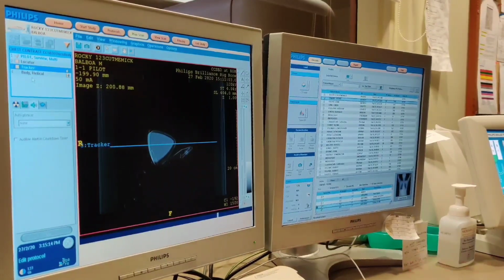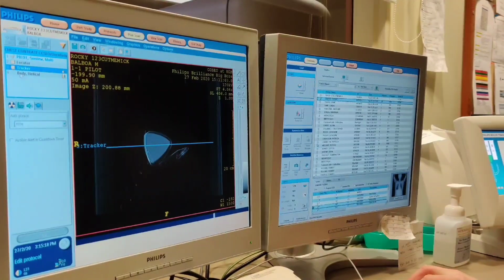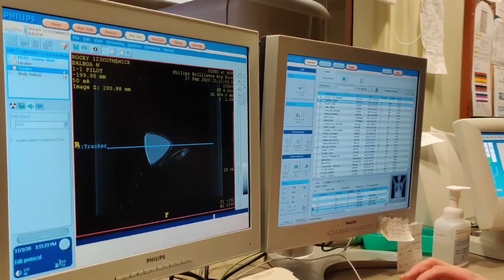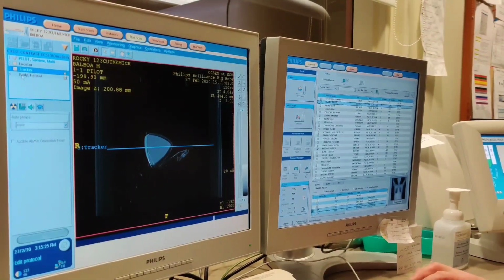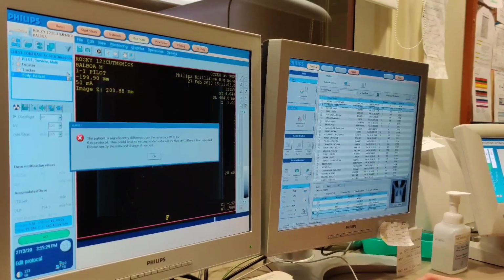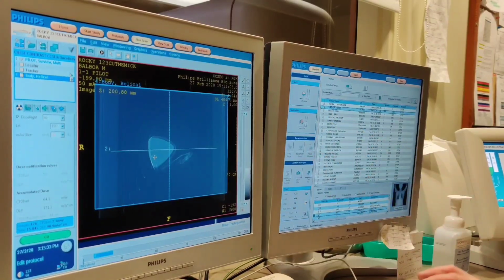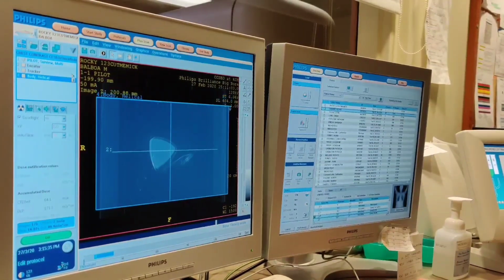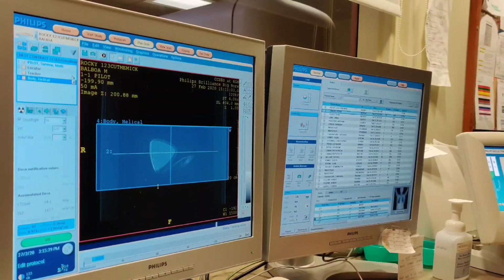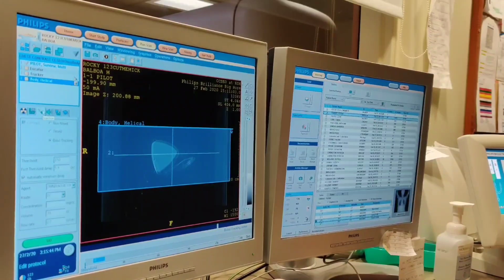And then last but not least, I need to map out the helical scan itself. So we've picked a level for our locator scan. We've selected all our parameters for the tracker scan. Now I'm just going to say okay to everything. We're planning out the actual scan. Again, for the demo I don't need a big long scan, so I'm just going to pick something short. And I'll verify all my parameters here.